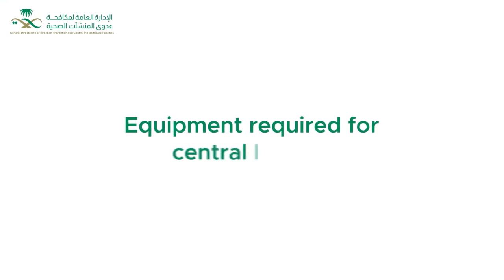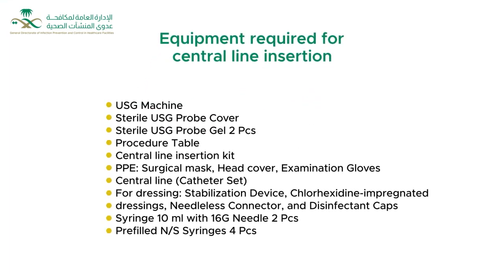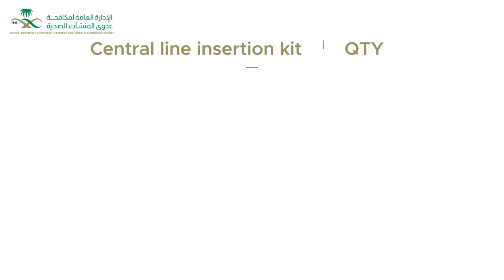Equipment required for central line insertion. Content of central line insertion kit.